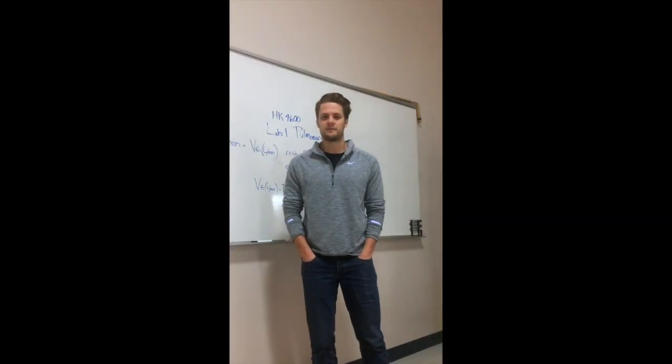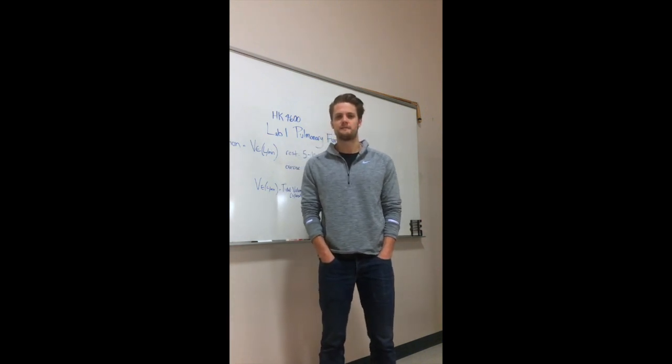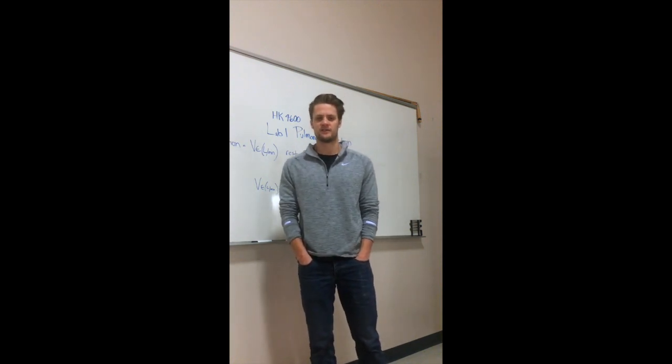Hey guys, welcome to Lab 1, and in Lab 1 we're going to be focusing on pulmonary function. Today we're going to be taking different measurements to evaluate lung function. But first, before we get into that, let's talk a little bit about the respiratory system.